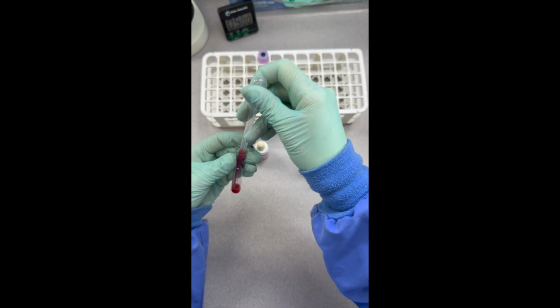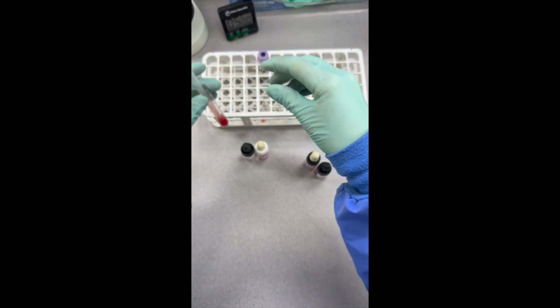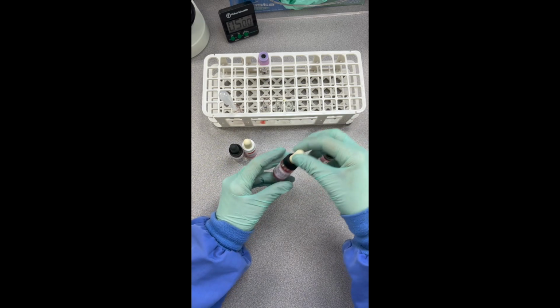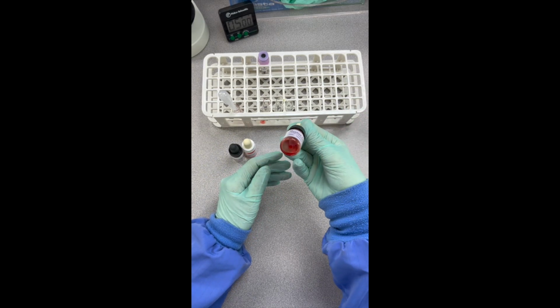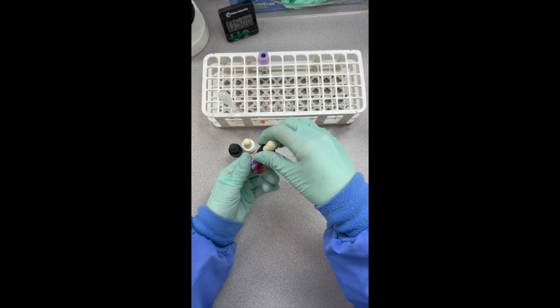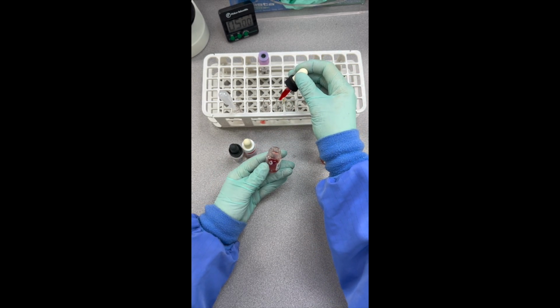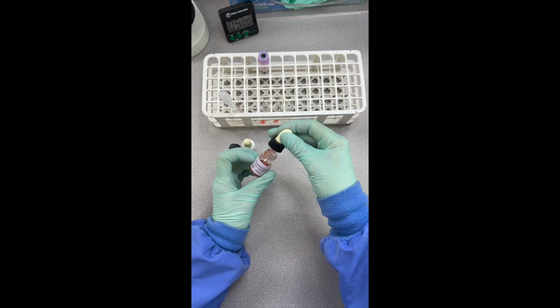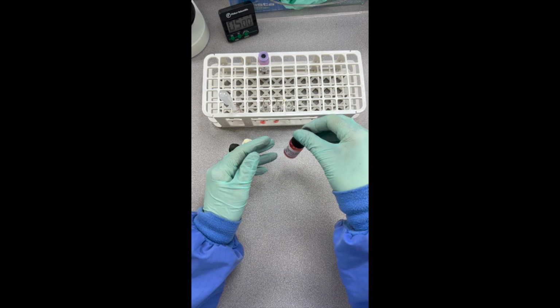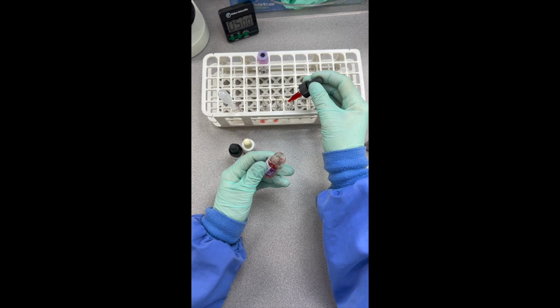And so at this point, we're going to add 1 drop to the tube marked patient. Then I'm going to put 1 drop of my positive, and remember, you want to mix your reagents well. And even squeeze that dropper to make sure you mix anything that might have stayed in the dropper. 45-degree angle, and we want to put a drop in there, and that's the positive control. Squeeze that out. Okay, here's our negative control. We're going to mix, squeeze that, and then we're going to put that drop in there.